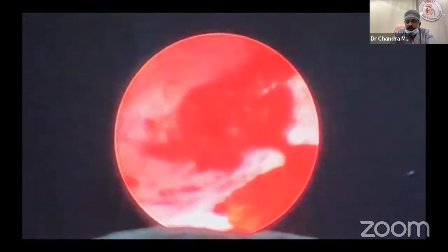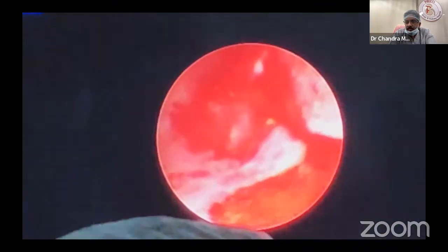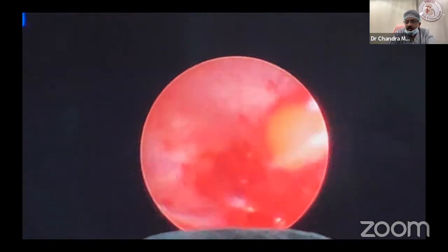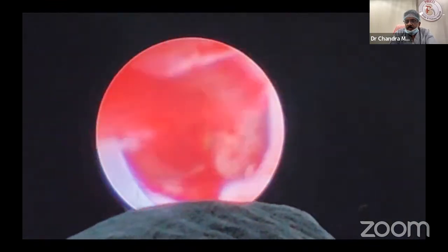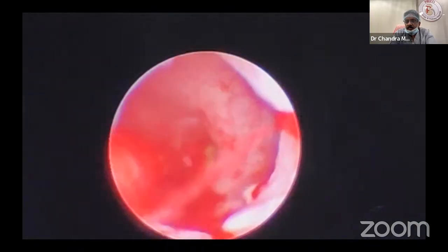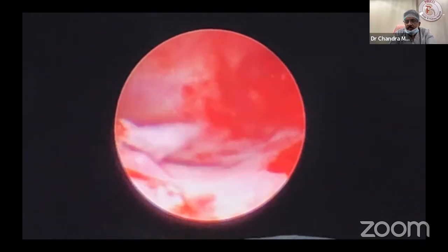This is a stone. So bleeding is not torrential. Stop. Next: whether my puncture is correct or not, how will you assess? You withdraw slowly, the guide wire is not there. You can observe all around the infundibulum, and there is no bleeding. Can you see the infundibular opening?